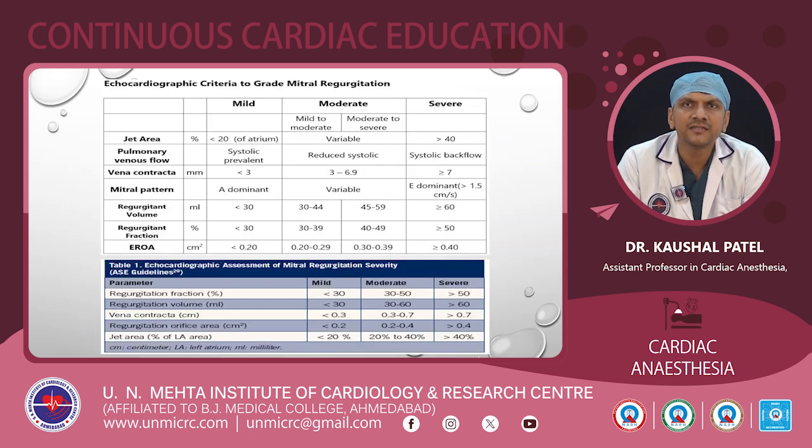Now, this is a basic evaluation, the different echocardiographic evaluations for grading mitral valve regurgitation. It is divided into mild, moderate and severe. Moderate is also divided into mild to moderate and moderate to severe categories.